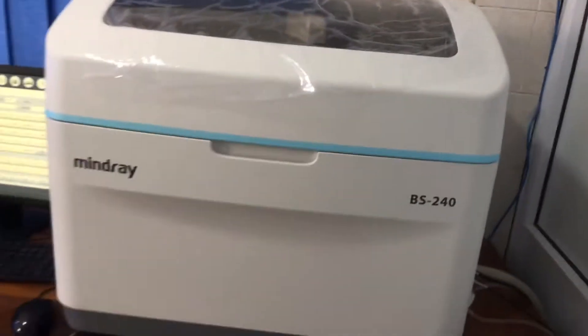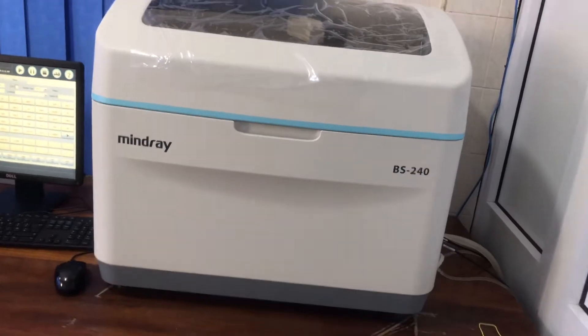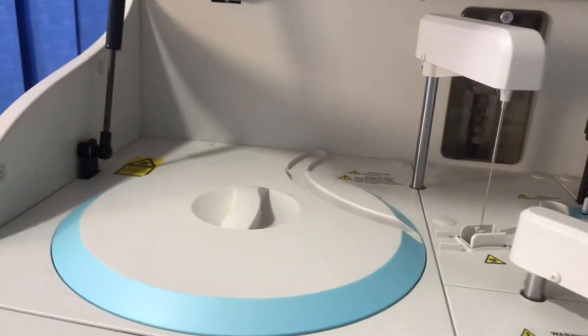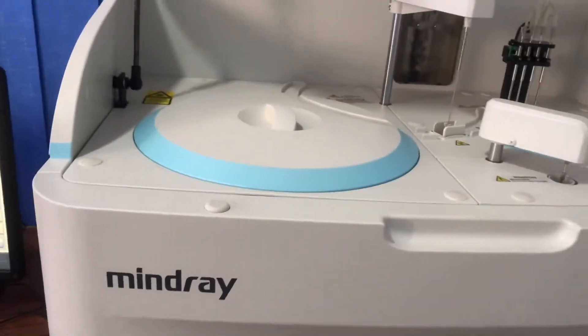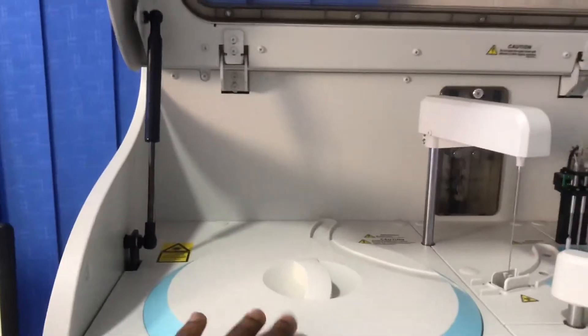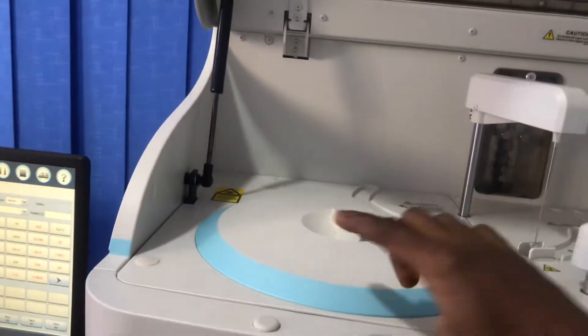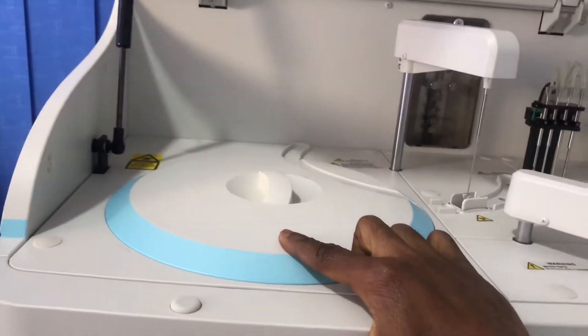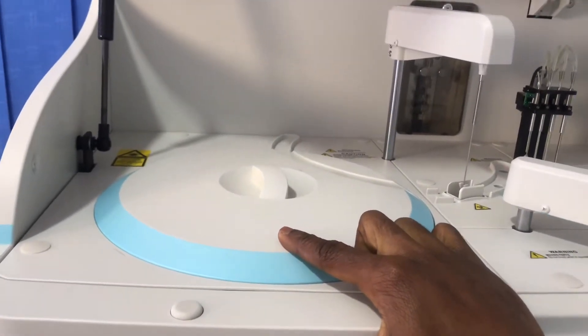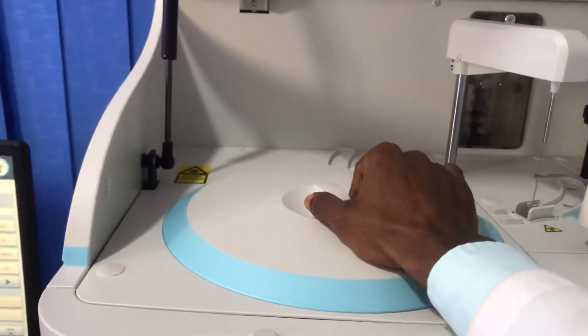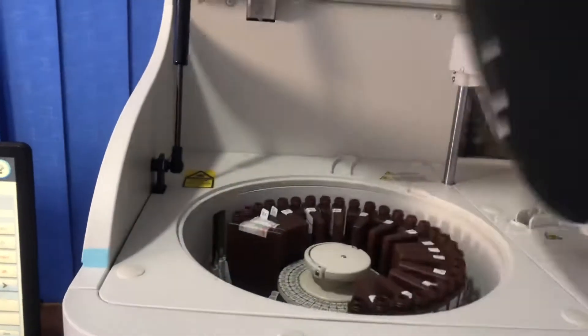So this is how it is when closed, and open. So let's start. This side is where we have the sample and reagent carousel. So I'm opening it now.